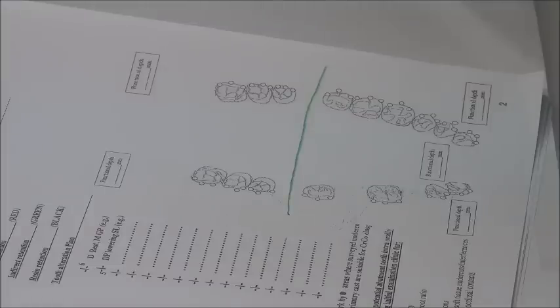What plate? Okay. The lingual plate is also the shape of the lingual bar when it extends to the saddle area. We also call it a plate. This is a good question. He's saying, why did I call it a lingual plate although there are no teeth to put a plate on? Okay, there are no anterior teeth. Where is the plate? The extension of the lingual bar into the saddle area, we also call it a plate. We don't call it a lingual bar. Okay? Yes.